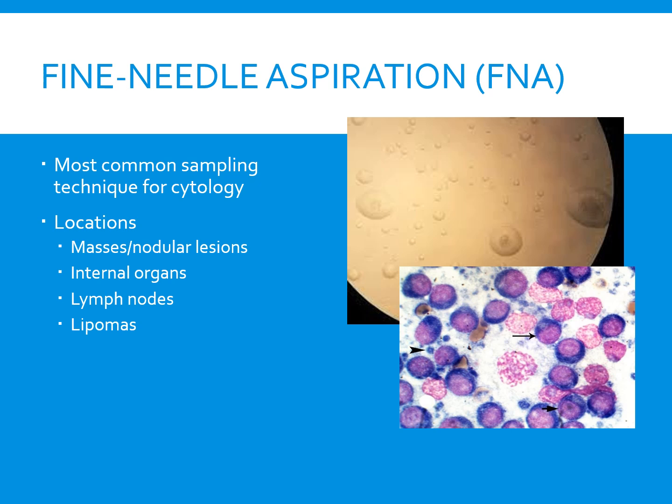So these are very handy for lipomas, for example. And if you look on the right, the top picture is fat cells. And if we poke a lipoma and we see on the slide that it's mostly fat cells, then that's a quick, easy diagnosis for a lump or bump. And then on the right bottom, you can see that these are cancerous cells taken from a cancerous lesion.